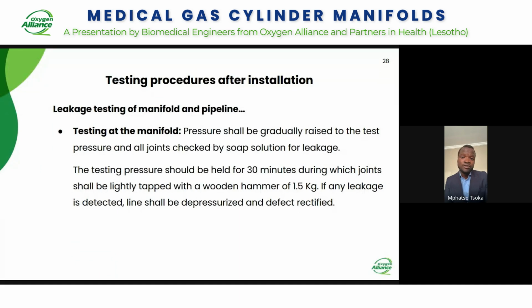Like we said, it's going to cause accumulation of oxygen in that room, and it's going to increase the feeding time. Instead of 2 hours to feed, for example, 5 cylinders, you end up taking the whole day to fill 2 cylinders because there's a lot of leakage on the cylinder feeding manifold. The same thing applies to the backup supply manifold. If the leakage test is not conducted, you put 20 cylinders today, if it's the 10 by 2 or 2 by 10, and by tomorrow all the oxygen has leaked out before a patient even used it, because the leakage test was not done, and all the joints or all the isolation and valve points are leaking. So it's always crucial to do a leakage test on the manifold and on the entire system or pipeline, to ensure that your manifold or pipeline can withstand and hold the pressure within the time.